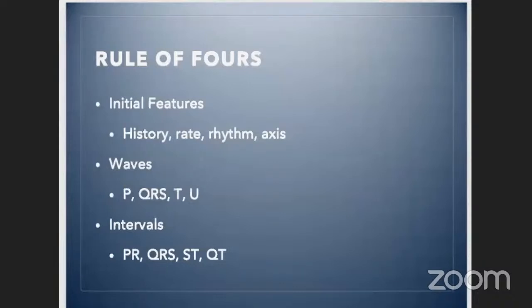Intervals are often something that we don't really appreciate or use to interpret our ECGs, but they do add a lot of value to what we can gather from ECGs. And going back to the initial features and our history, it's very critical that we know the indications to do ECGs.